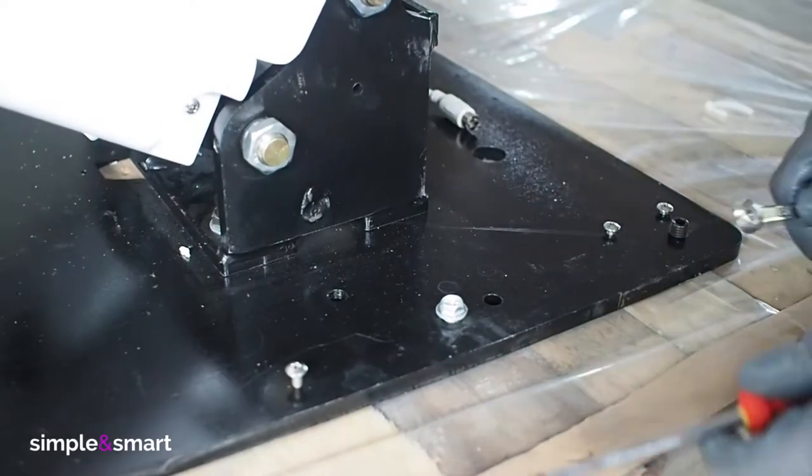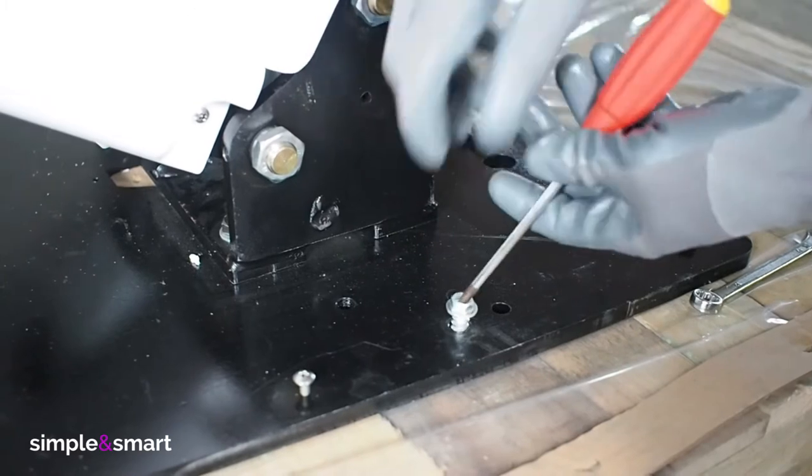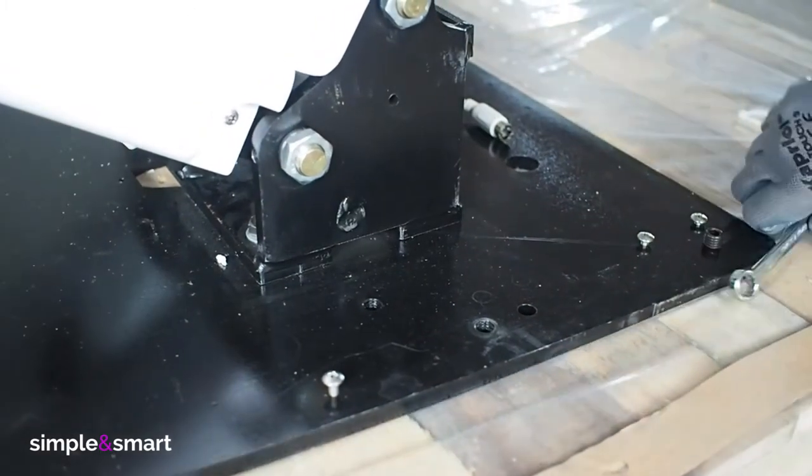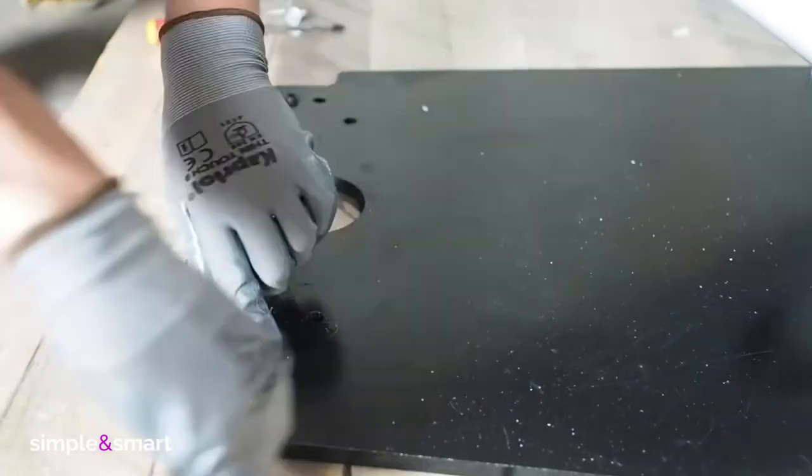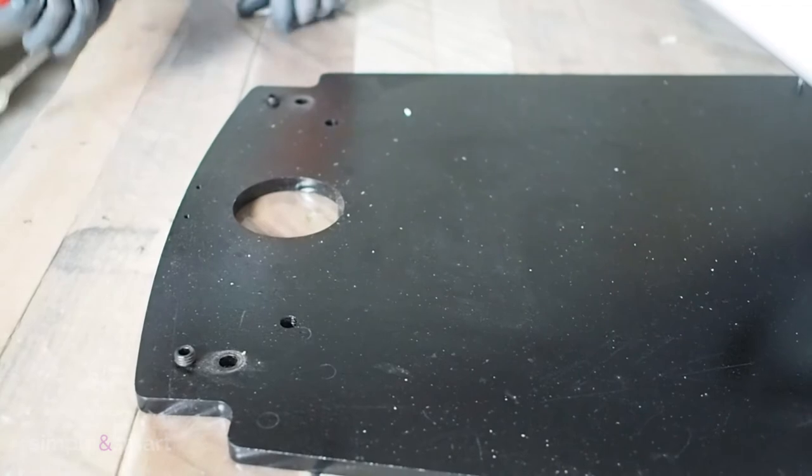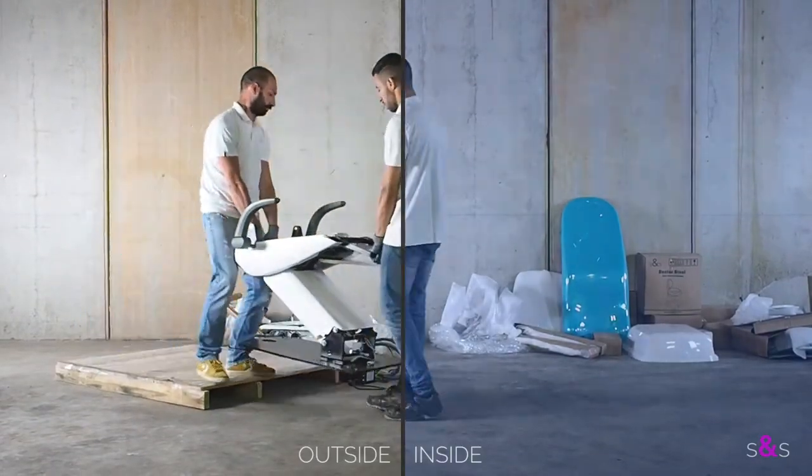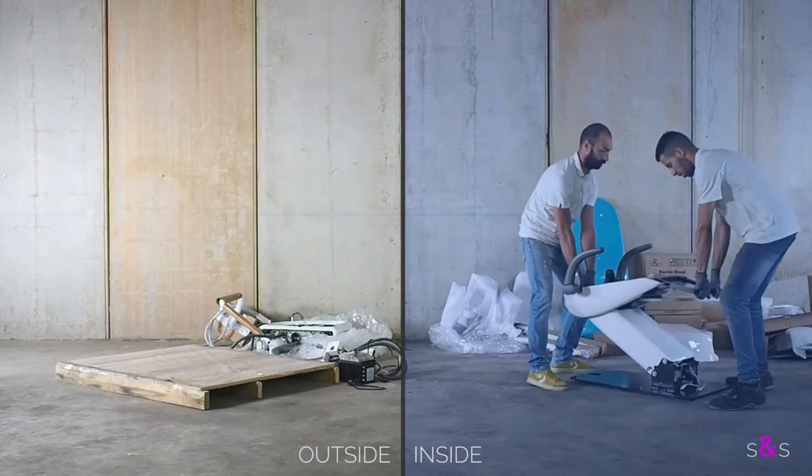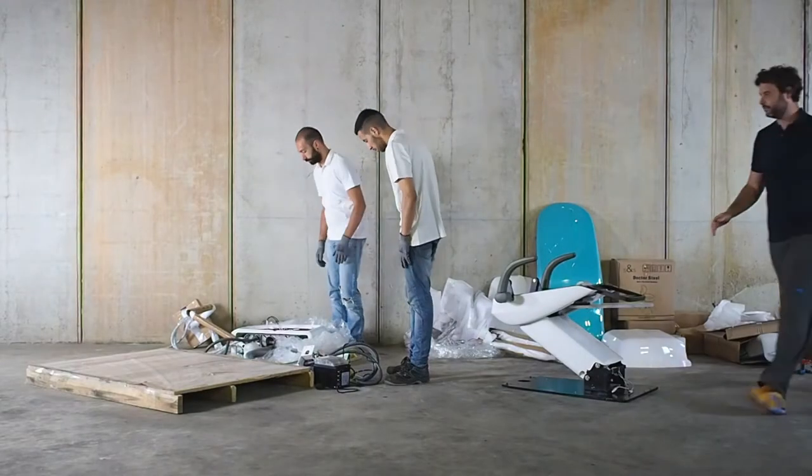Remove the screws that keep the dental chair on the wooden pallet. Take the chair inside the clinic. You can use a cart if you have it. It will simplify handling the heavy chair. Call an extra person to help you for a couple minutes.